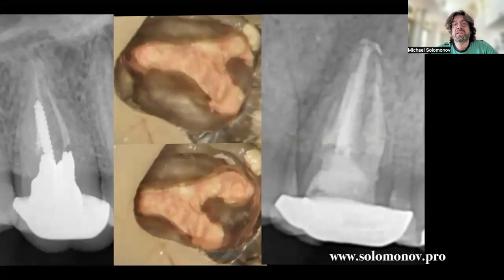You can see, and I finish with a temporary double seal, and I will invite this patient 6 months later. And in this specific case, I think I will use CBCT for follow-up, because just CBCT will give me the result of the situation and the sinus and the final understanding of what we can have in this specific case. Thank you. I hope it was interesting for you.